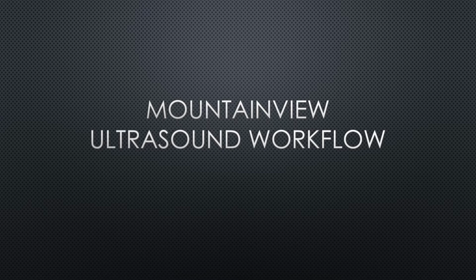Now, for those of you who have been joining us for the physics or the knobology, you may not find this last lecture as helpful unless you're trying to set up a workflow of your own and you want an example of how it's been done elsewhere. If that's the case, or in any case, you are more than welcome to join us for this lecture as well, but with the caveat that this may be less useful and less generalizable than some of my previous lectures.